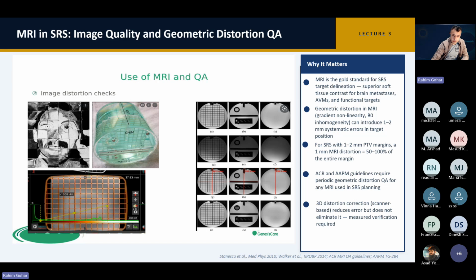All right. So what we did was we got the 3D phantom. Within our institution, we do have the 3D phantom, and then we took it to that hospital. We did the MRI, and the challenge was putting on the coils, because we can't use the head and neck coils for this phantom, so we were forced to use the pelvis one.